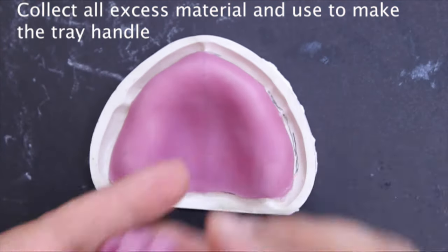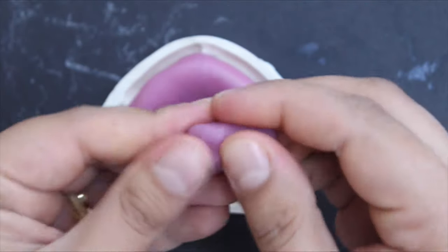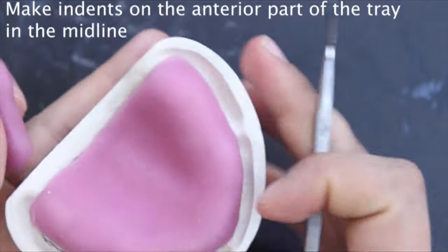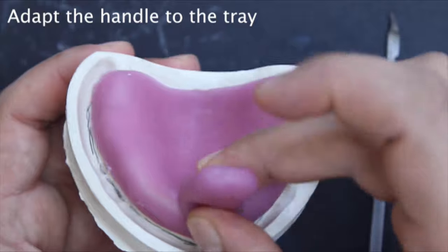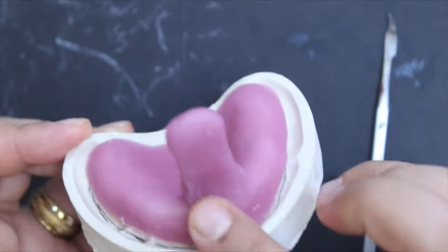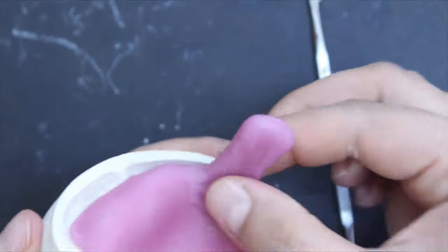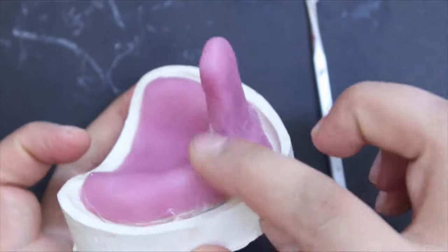Now to make the tray handle, collect all the excess material and shape it into a cylinder. From one end, cut halfway and shape the material with your fingertips. Place it over the tray in the midline and adapt it to the base of the tray. Make sure that the handle is set at around 90 degrees so that it does not interfere with the lip while making the impression, and that the top third of the tray should be slightly curved to allow the dentist to hold the tray while making the impression.